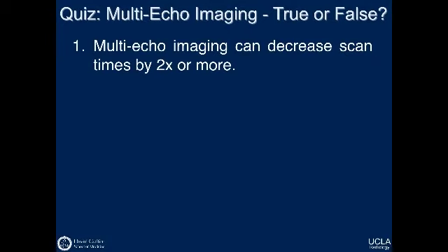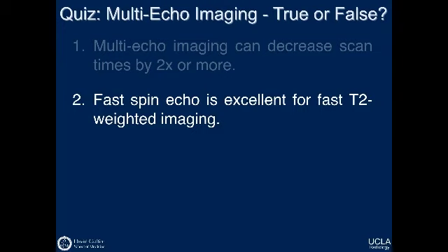Okay, so something about multi-echo imaging. Multi-echo imaging can decrease scan time by 2-fold or more. True or false? True, right? We use it all the time to go 10 times faster.